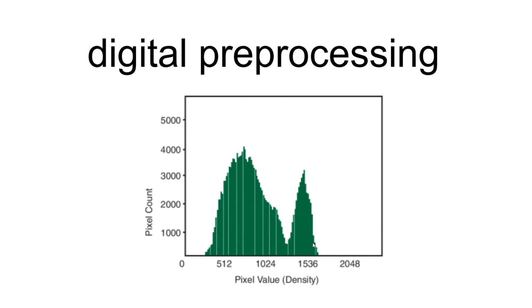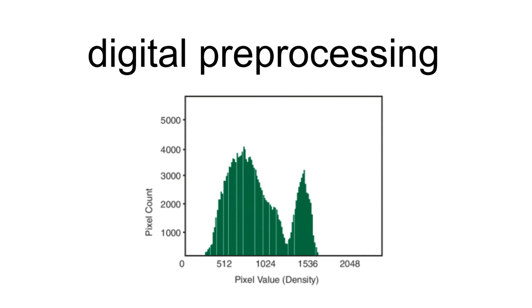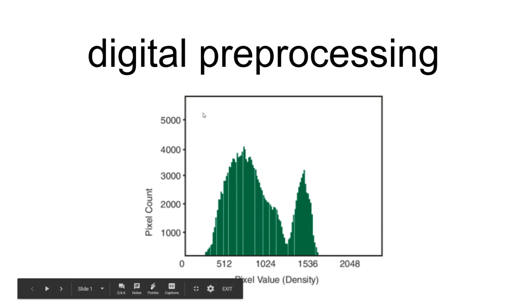So this might be oversimplified because, as we've learned with bit depth, you can have hundreds of grayscales, and it looks like we only have a few lines here. Okay, so this is not drawn really to scale, but if you imagine each one of these as a bucket, whatever this grayscale is in the middle over here is going to have less of that particular gray, light gray, dark gray, whatever it might be, than these up here.